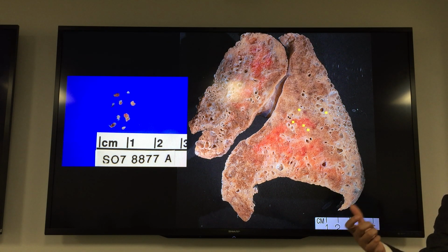You're putting the forceps in and hoping that something will show up. Because it's a blind procedure, you won't always get the lesion. Sometimes you'll get pieces of normal lung, sometimes non-specific fibrosis or chronic inflammation. It actually happens quite often. So you should know during sign out not to expect that every biopsy will have an answer. All right?